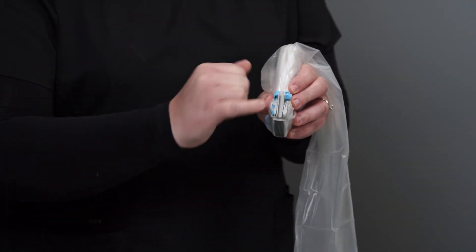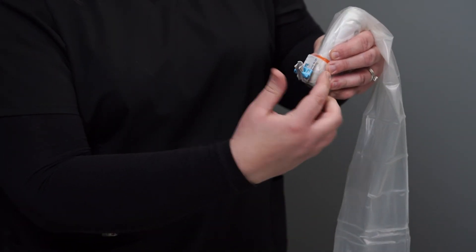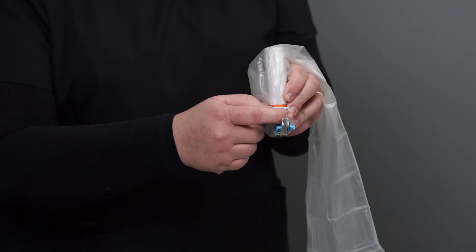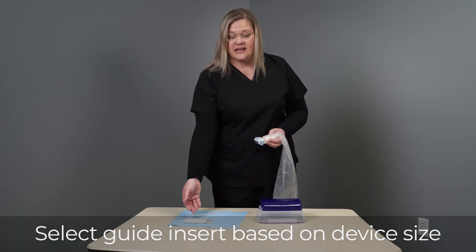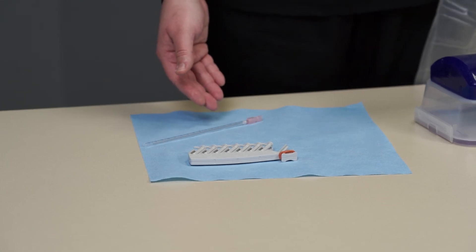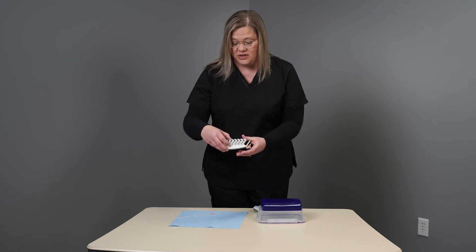One point to make sure of when applying the Versa guide body is that you can clearly see all of the numbers in the correct direction as if you were scanning. Within your procedure you will want to identify your device size and choose the corresponding guide insert on the tree. Today I will be using an 18 gauge FNA device, so I will choose the 18 gauge insert off the tree.